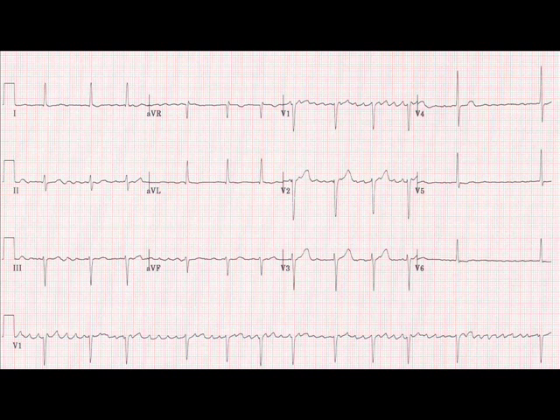The QRS complexes are normal — they're narrow. This is because the ventricles, however the electrical activity is generated in the atria, as long as it travels down the normal ventricular route electrically — that is, down the bundle of His and the bundle branches — that's the quickest route through the ventricles and you'll get a normal QRS complex.